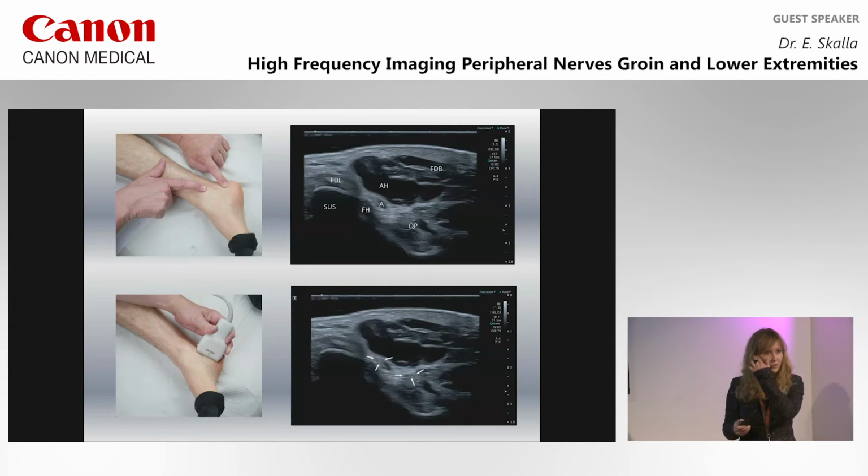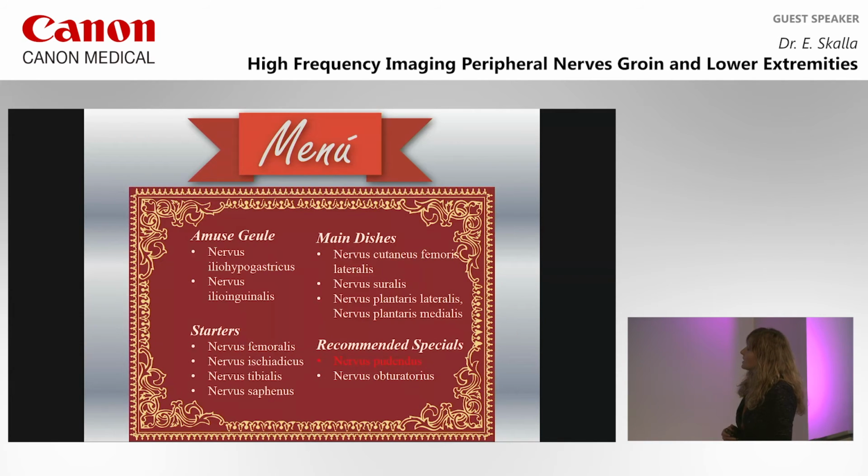You can try to follow them more distally, but the problem is the blurring of the plantar aponeurosis. But in the book, we also have pictures there, but we will take time to see them. So we're coming to the end.